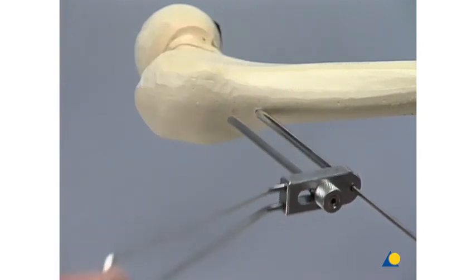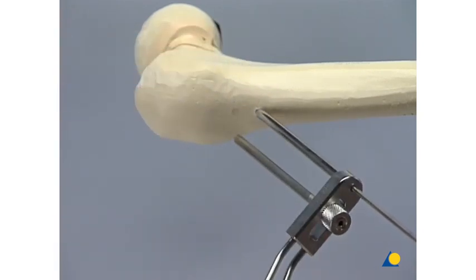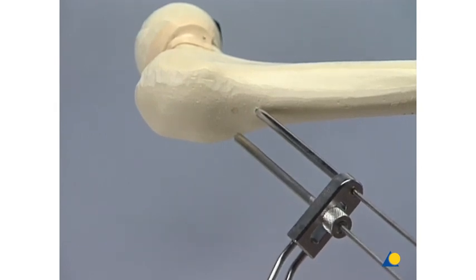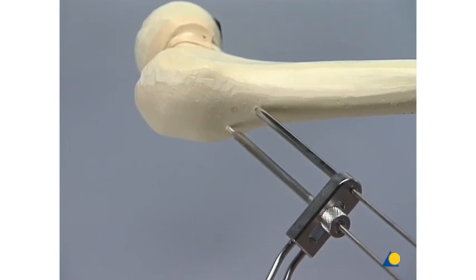We now introduce the second and third guide wire in the desired position. The reduction and placement of the guide wires is once more checked with fluoroscopy in two planes.